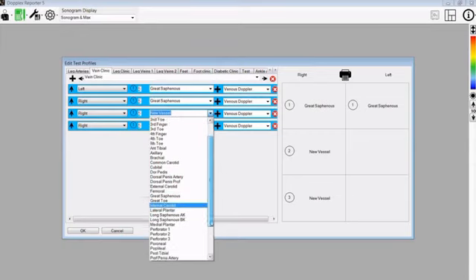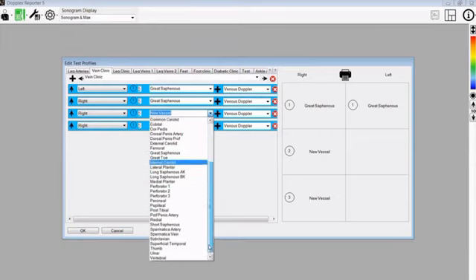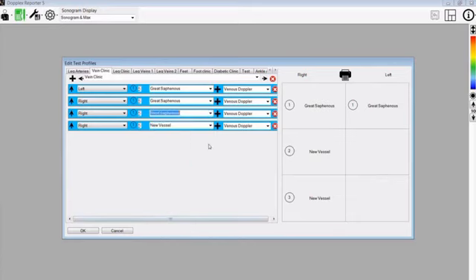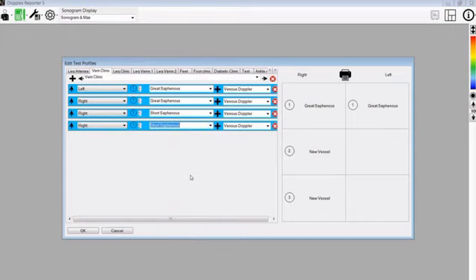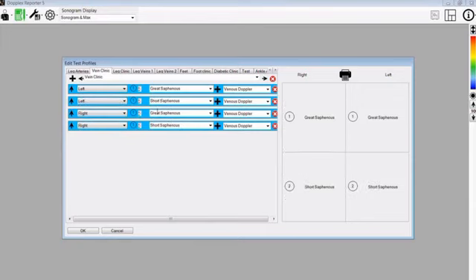So we are looking for the short Saphenous Vein, and we will do the two lefts together and the Great and Short Saphenous on the right side. This is the order in which we will undertake the measurements.